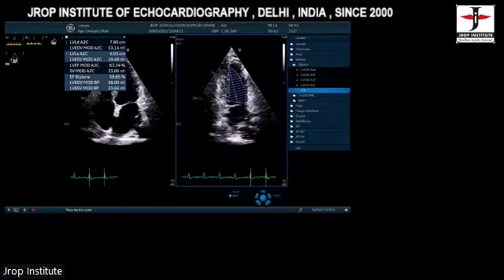Dr. Veena Bang, unmute yourself. Yes, hello, sir. Go ahead. Can you please tell us how to look for pulmonic artery again? Pulmonic artery. All right. Can you lower your hand, Veena?